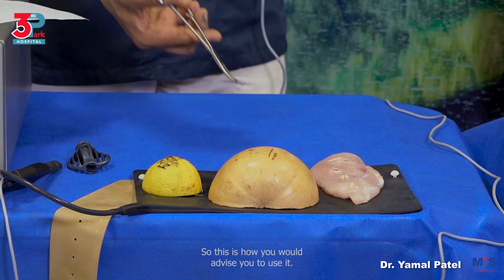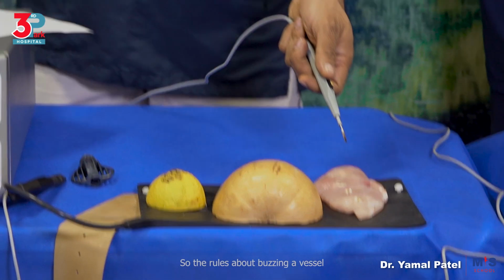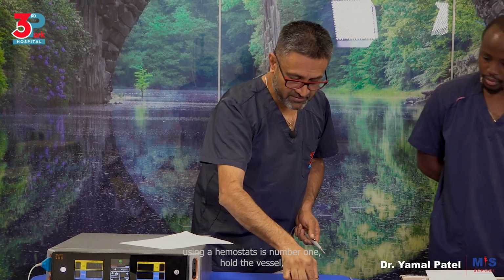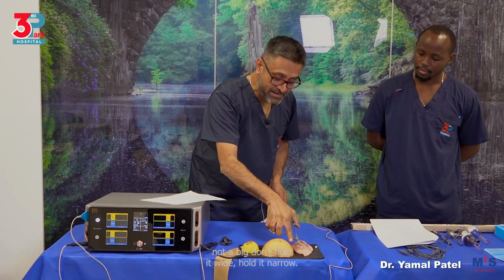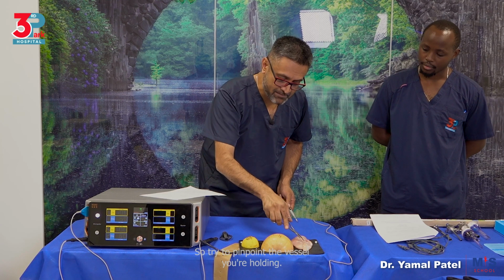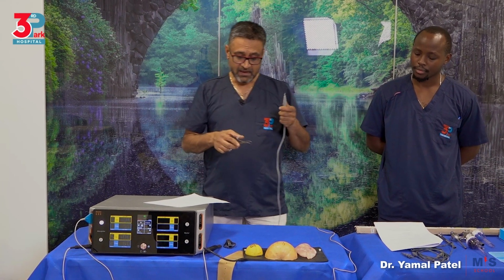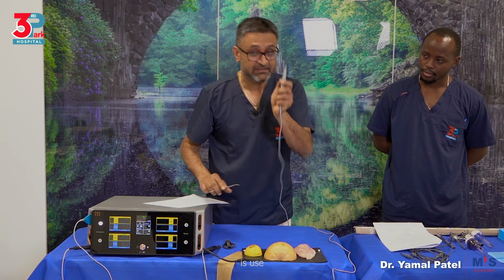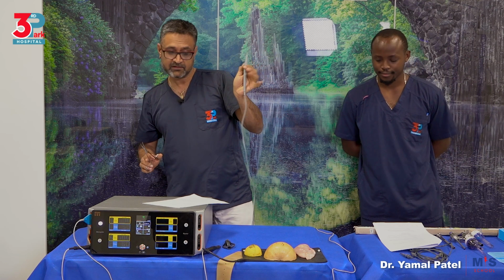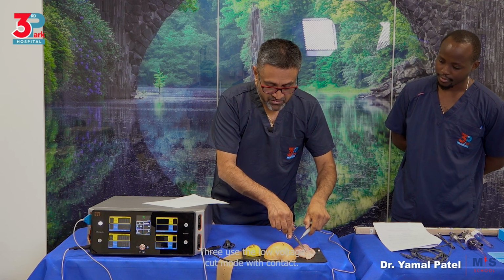So this is how we would advise you to use it. The rules about buzzing a vessel using a hemostat are, number one, hold the vessel, not wide, hold it narrow. So try to pinpoint the vessel you're holding. Second thing is use the low voltage yellow cut mode. Three, use the low voltage cut mode with contact.